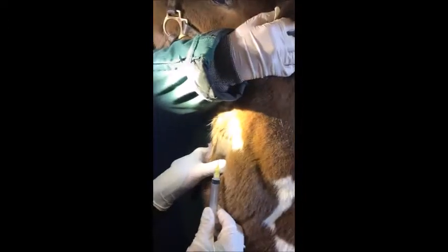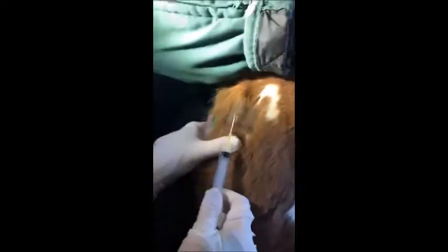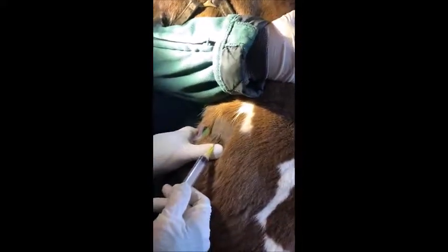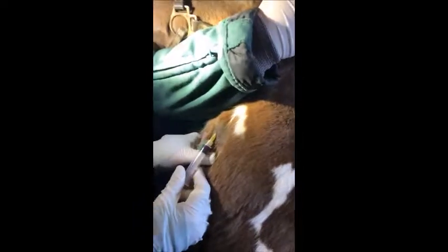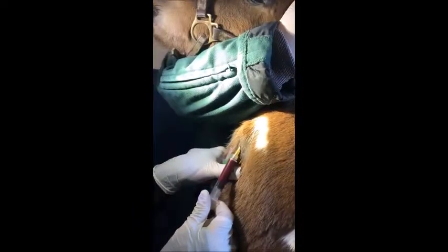Again, just kind of wipe off the vein, take your five milliliter syringe, and occlude the vein. You can see the vein bulging right there, very obvious. Insert the needle parallel. Obviously, you're hitting a moving target, so that's always a challenge. And draw back. And you're done.